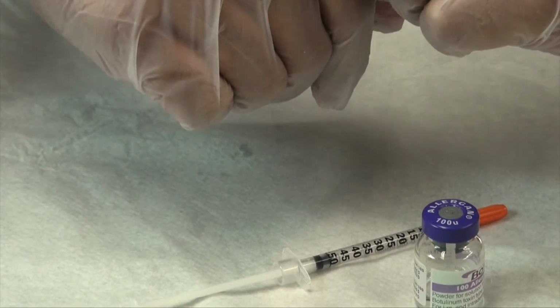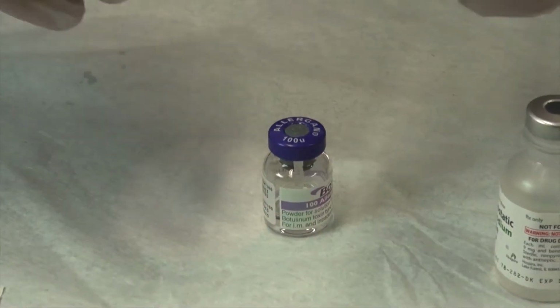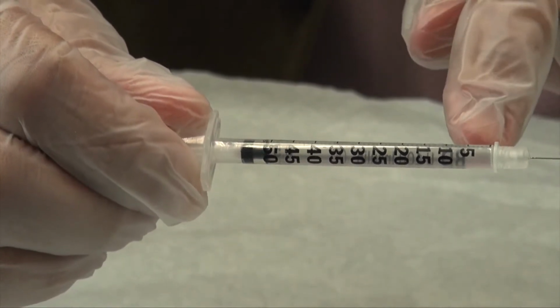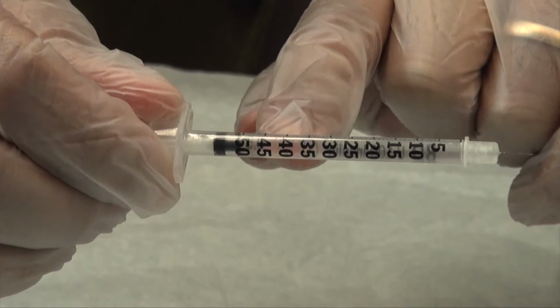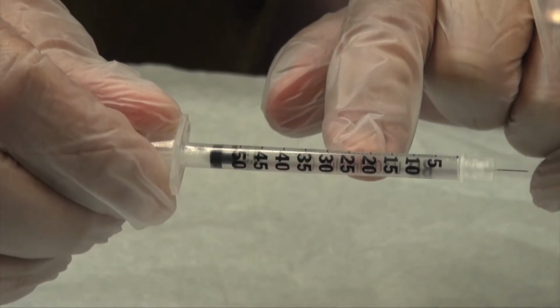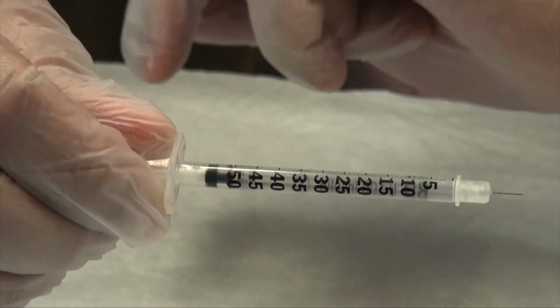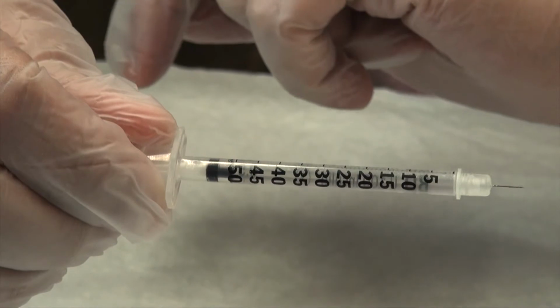100 units in 2.5 mils of saline is equivalent to 20 units in 0.5 mils of saline, 20 units of Botox in the 0.5 mil syringe. This equates to 2, 4, 6, 8, 10, 12, 14, 16, 18, 20 units of Botox. So 2 units per 0.05 mil graduation.